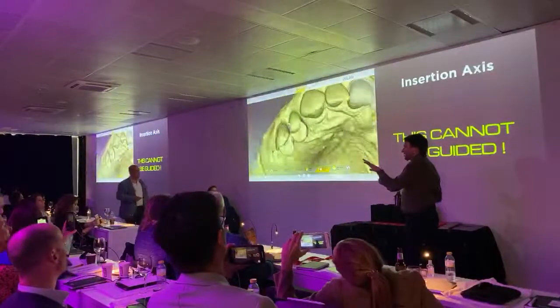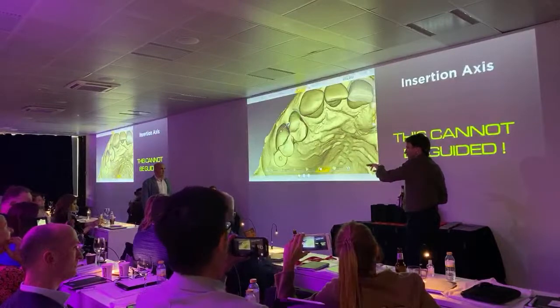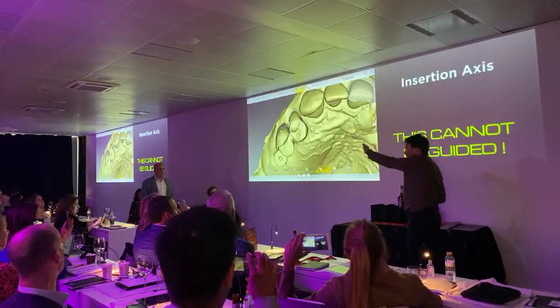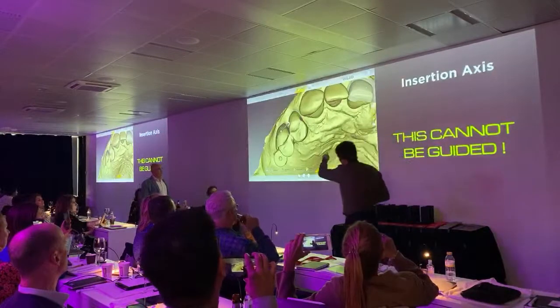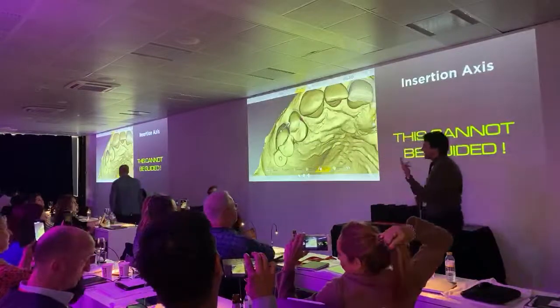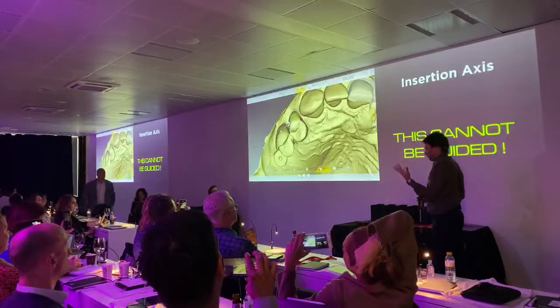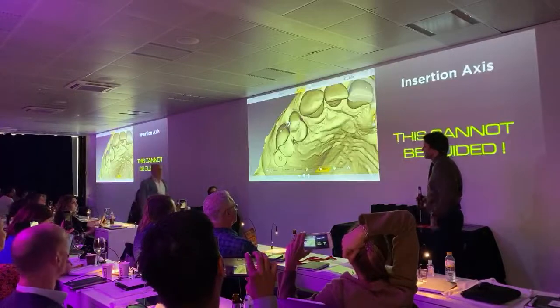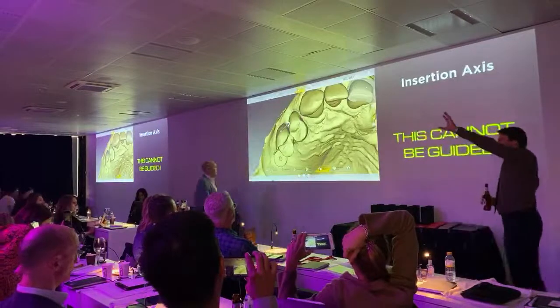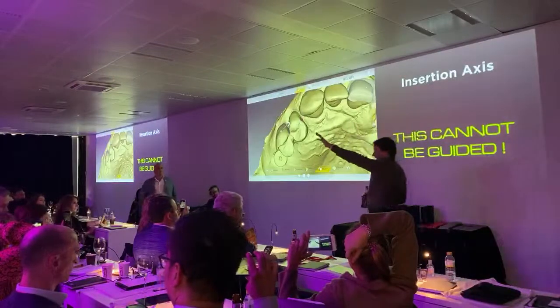So besides the 3-step guided process plus the 3 quality control guides, you're actually using 5 guides. After that, you scan and you go to the screen and do this analysis for path of insertion, undercuts, visibility of the finishing line, clearance, and the fifth, sharp angles. These are 5 principles that you need to analyze chairside. I believe everybody made notes of this in residency 1.